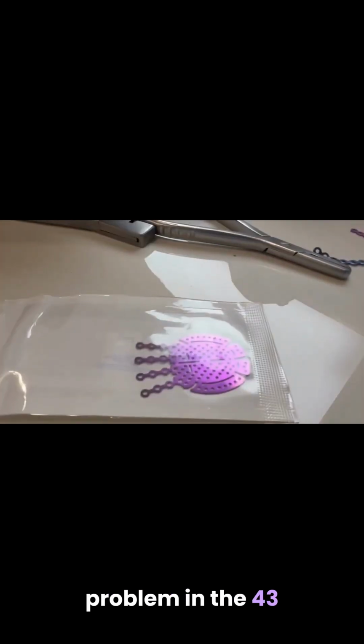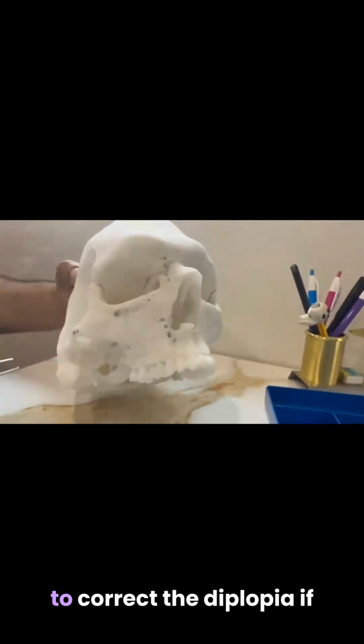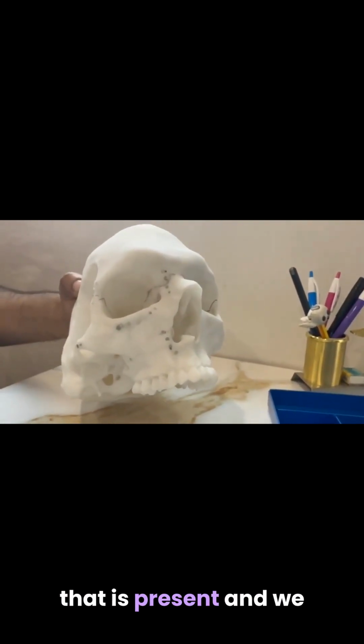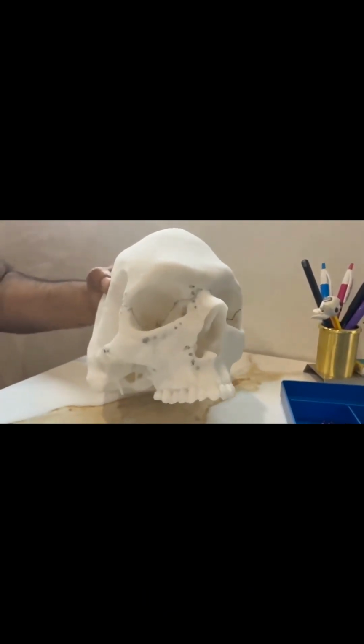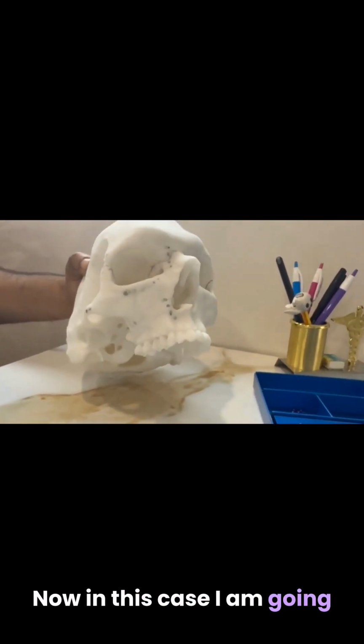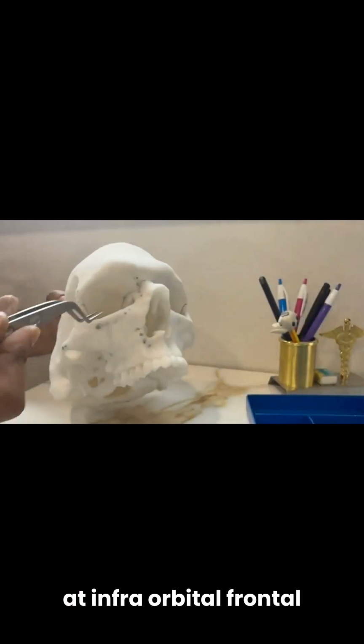Telecanthus is a common problem in Le Fort 3 fractures. So we have to correct the telecanthus, we have to correct the diplopia if that is present, and we have to manage according to all those things. Now in this case, I am going to show you the plating at frontozygomatico-maxillary, infraorbital, frontozygomatic, and zygomatico-maxillary.